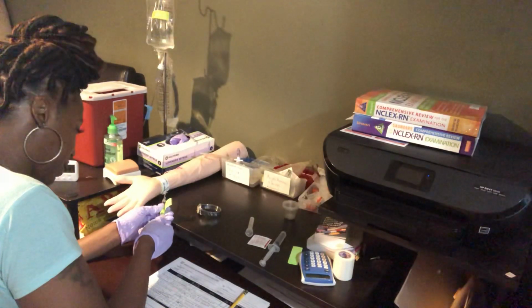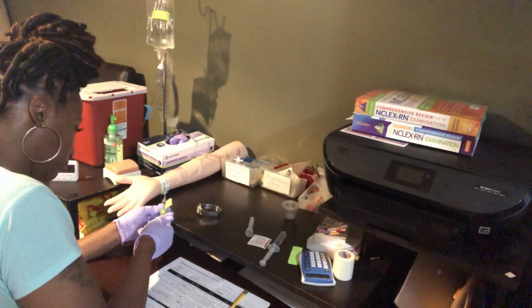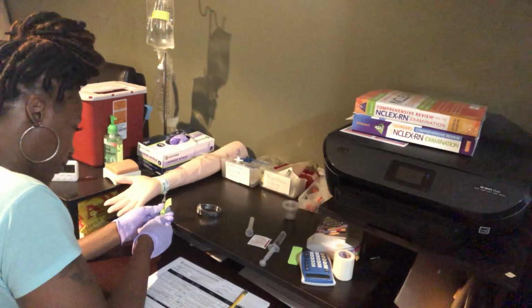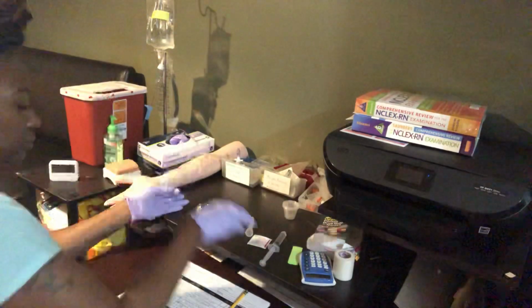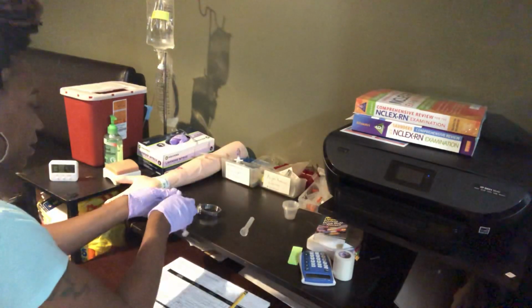About 15 seconds. All right, got it all in there. Sharp container. Clean the hub. Normal saline.